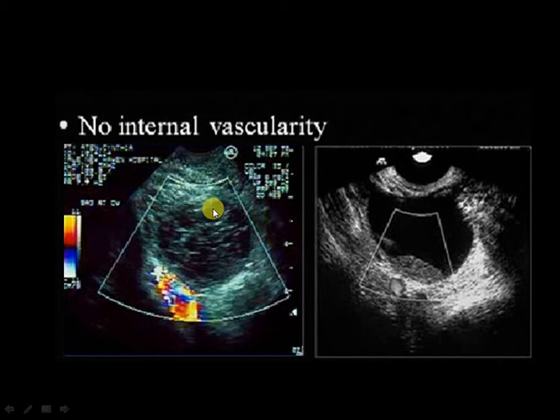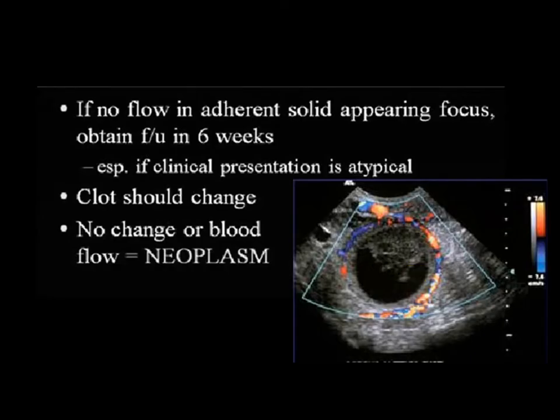You can see here the hemorrhagic cyst with absolutely no internal vascularity. If you are unsure whether it is a hemorrhagic cyst with clot formation or a cystic tumor with a mural nodule, do follow-up ultrasound after six weeks. The cyst will definitely change — it will regress or may increase in size if there is re-bleed — while the tumor will not change.